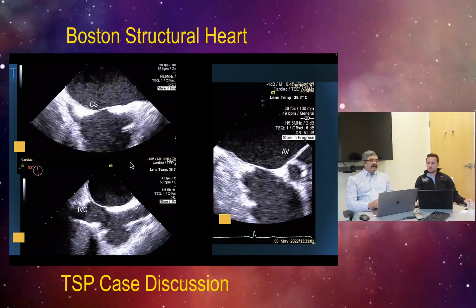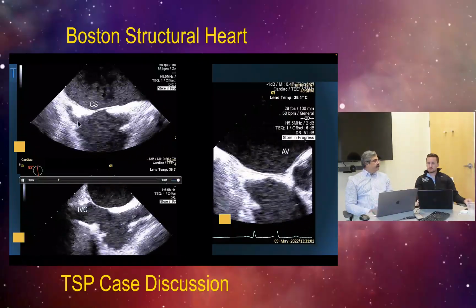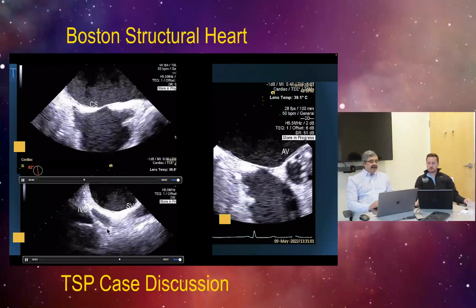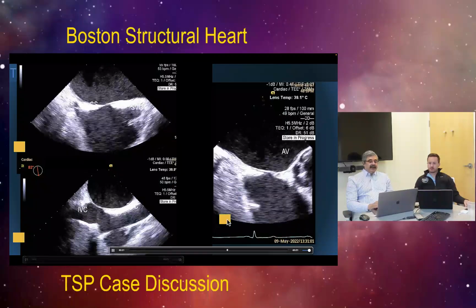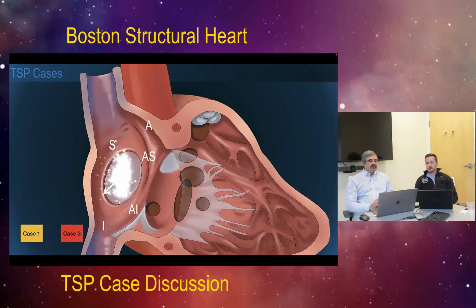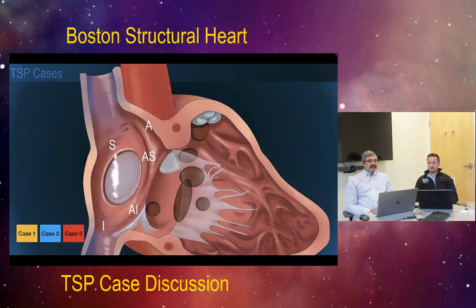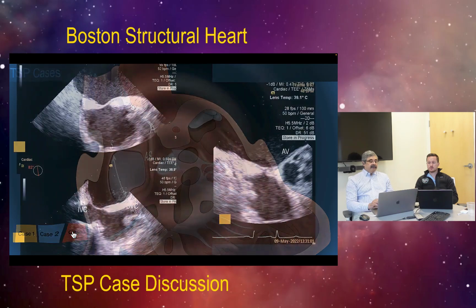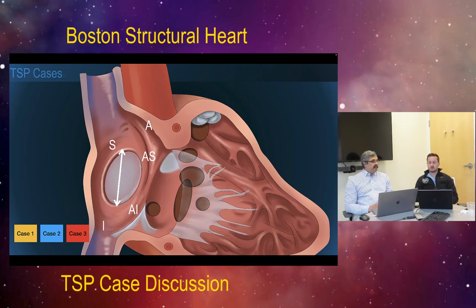Again, this is the coronary sinus, like you pointed out. Here you do not see the eustachian valve, and as you can see, this is the IVC. You're beginning to see the eustachian valve, so that brings in that point, and this is the anteroposterior aspect. Back to again, to reinforce, this shows the anterosuperior and posterior aspects. This is the coronary sinus showing over here. So obviously this section is between superior and more anteroinferior. And if you look at this one, where you're seeing the IVC here, this shows a more superior-inferior direction as opposed to that one. So there's a slight difference in this one when you look at it here.